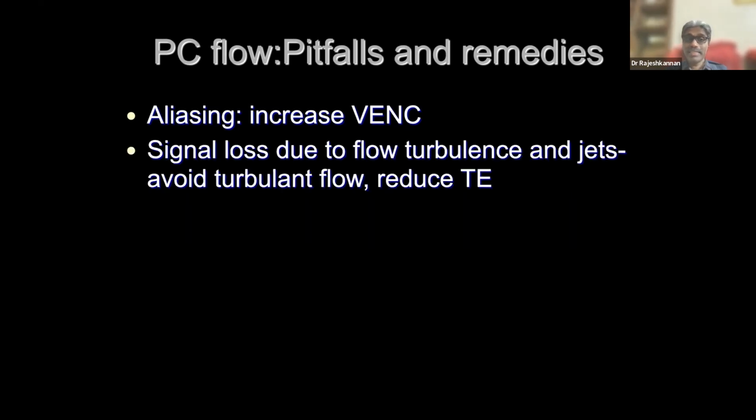Second is the signal loss due to flow turbulence, which can happen under the jet. The best way is to avoid taking the measurement from that turbulent jet, and if you are doing it, try to use the TE as low as possible.